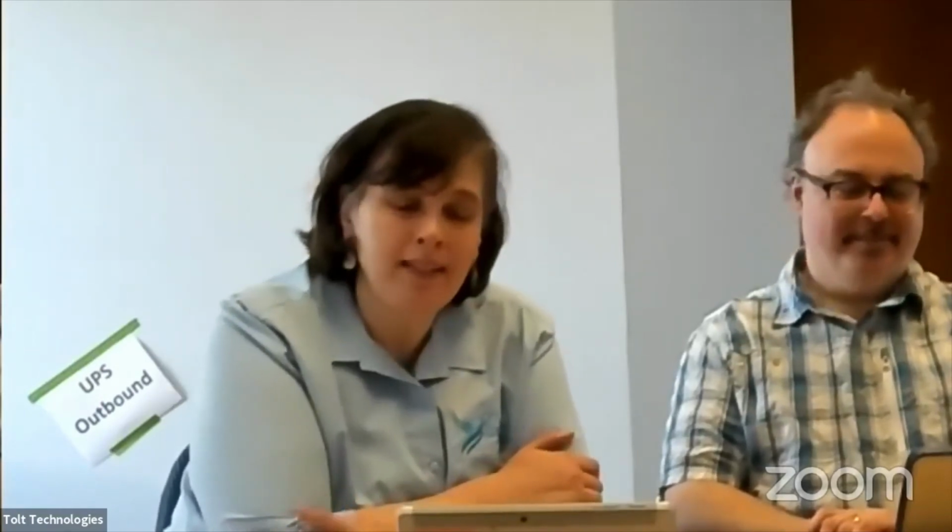In my testing of it, it worked quite well unless the sunlight was coming directly over my shoulders. And then the eye gaze bar kind of washed out and the chair wouldn't go because it wasn't picking up my eyes. I solved that by putting a sunbrella on the back of the chair, and then it worked fantastic. We have had some reports that in direct sunlight, like in Texas and stuff, it doesn't work quite as well, but it certainly works a whole lot better than the previous generation of eye trackers.